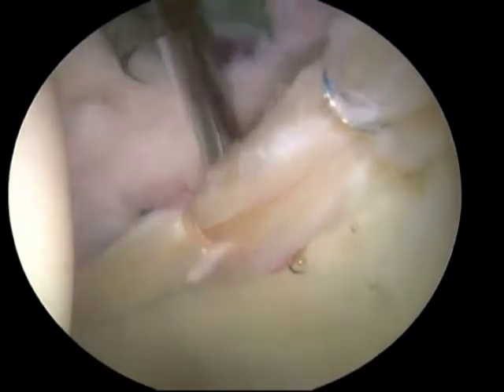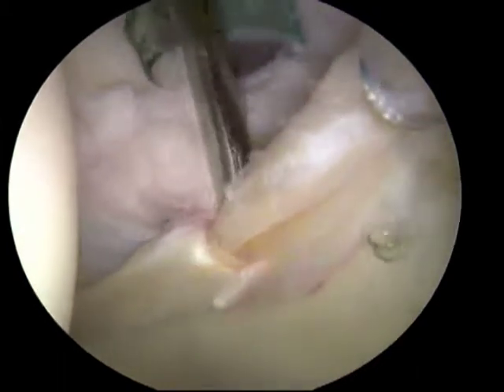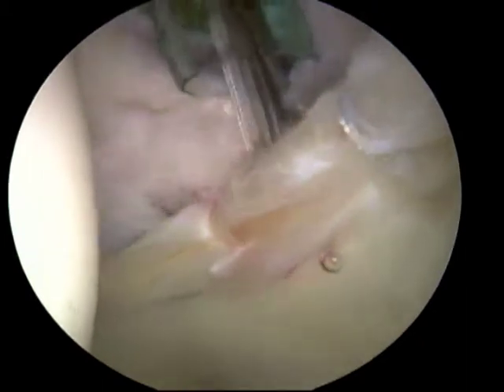Access to the labral tissue for repair can be accomplished with two or three portals, which are approximately one centimeter incisions that allow passage of the instrumentation and the camera.